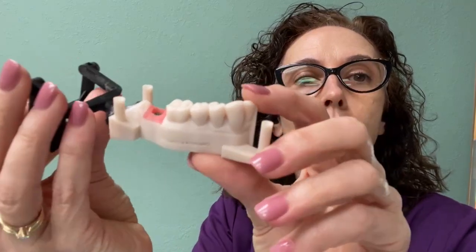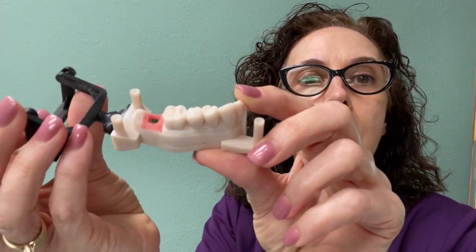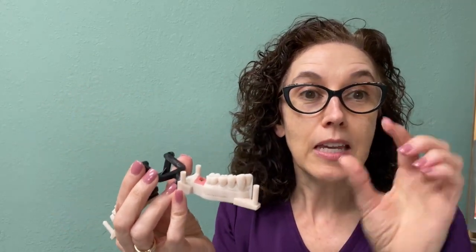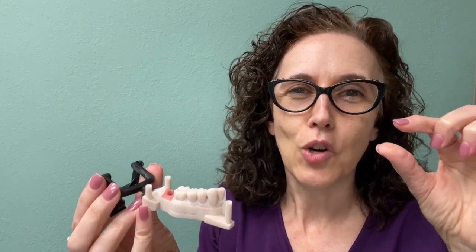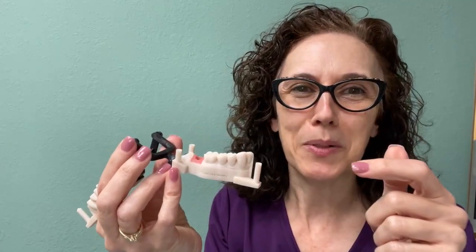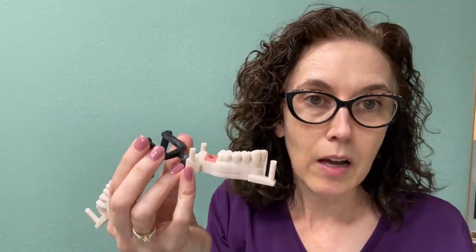And then you can see here, we again have that pink tissue. And that pink tissue I can remove, and you would then see a little bit of that implant sticking up. You don't normally see that because your gum tissue stays in place, but for the model, you can be able to see that. So once that information is sent to the laboratory, then they're going to fabricate 2 parts. One of them is called an abutment. Sometimes it can be a prefabricated abutment or a custom abutment, but that is the one part. And the second part is a crown, and then a crown will go on top of that abutment.